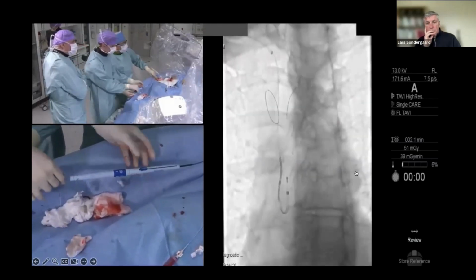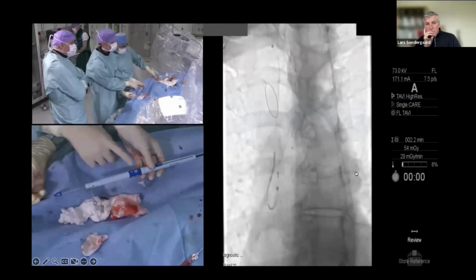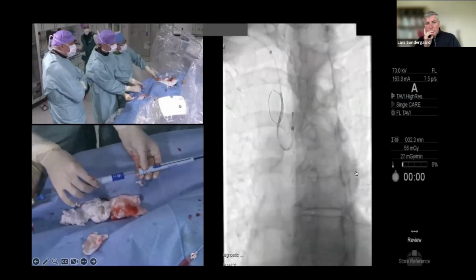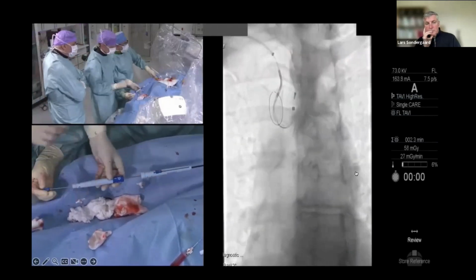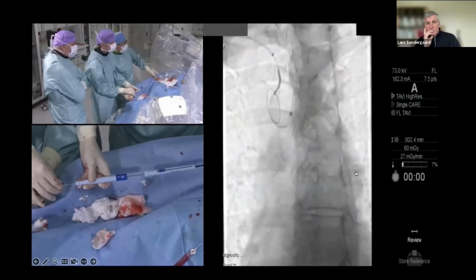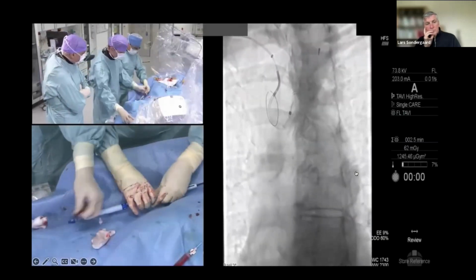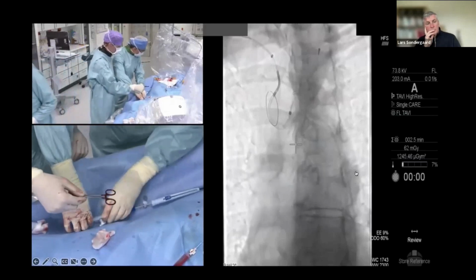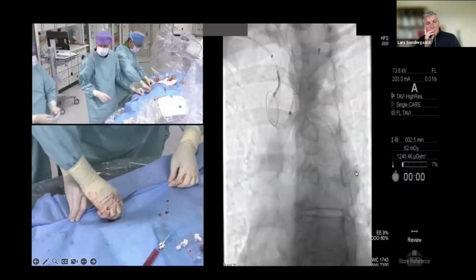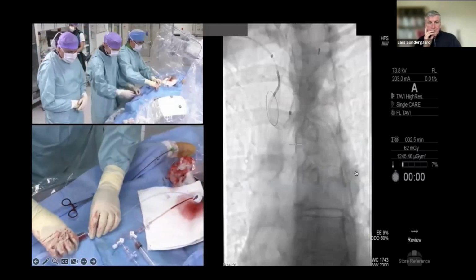Yeah, I can push maybe more. Wait a second. We know that the vessel makes such a small bend on the CT. So okay, now we have a good flex. Now we're going to split the handle to bring this curve to the carina and the outer curvature of the aorta. That's it. And now, as this holds the wire, we gently come out with the most distal filter. Number 3 here. Yeah, number 3, we push it out. So we see it takes only a few minutes to put it in, and even though we don't need to discuss the PROTECTED TAVR trial in detail, we have seen that it's extremely safe to do it. I mean, the risk of vascular complication is again close to 0 for using the device.